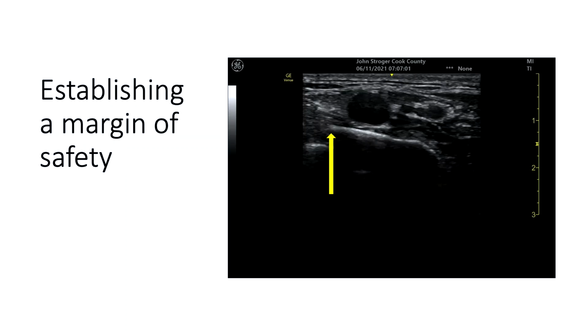So you will put the medial edge of the rib. So notice that this is the edge that looks at the pleura. This is the edge that looks at the first intercostal space. So what you will have as a working image would be an edge, the pleural edge of the first rib, located medial to the artery.